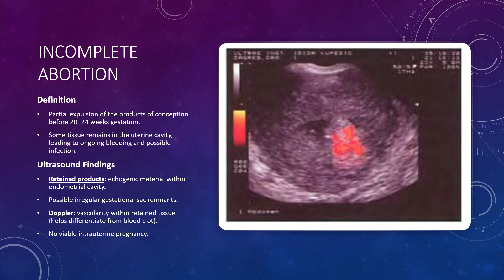With incomplete abortion, part of the pregnancy tissue is expelled before 20 to 24 weeks, but some remains inside the uterus. This retained tissue can cause ongoing bleeding and, if untreated, may lead to infection. On ultrasound, you may see echogenic material within the endometrial cavity, sometimes with irregular gestational sac remnants. Using Doppler, vascularity within the tissue helps distinguish it from a simple blood clot, and importantly, there is no viable intrauterine pregnancy.